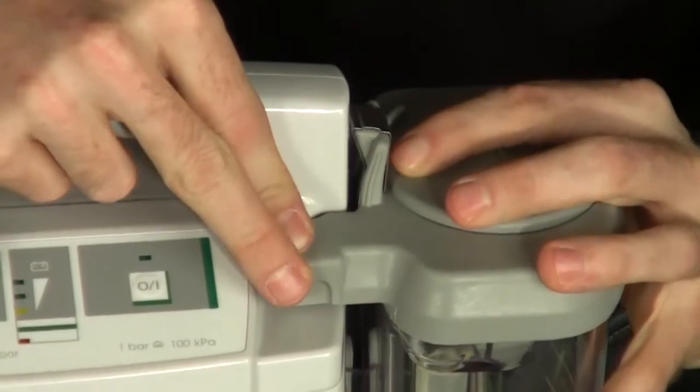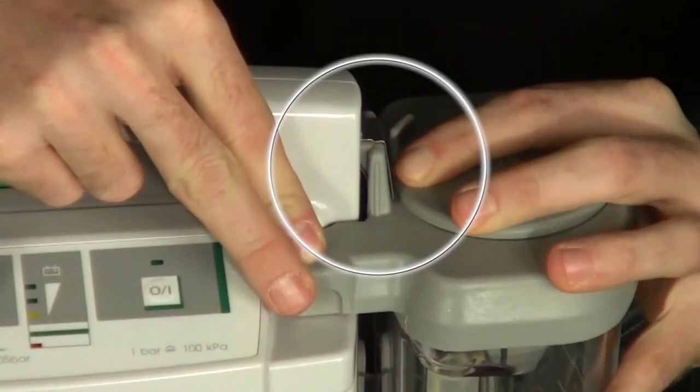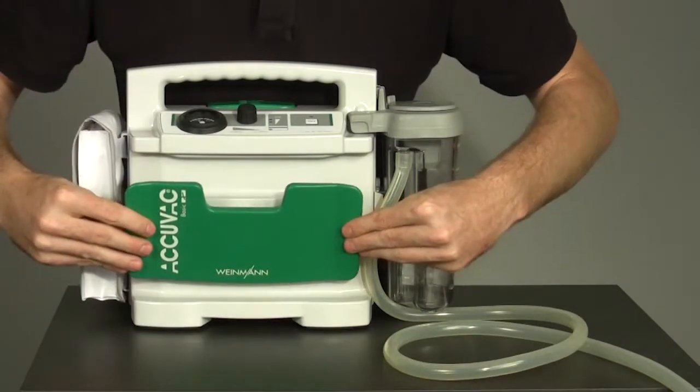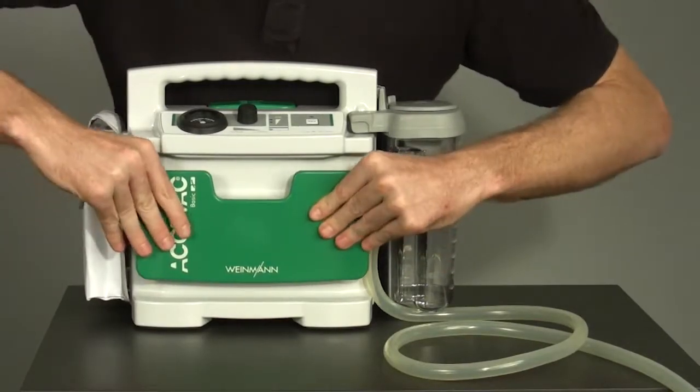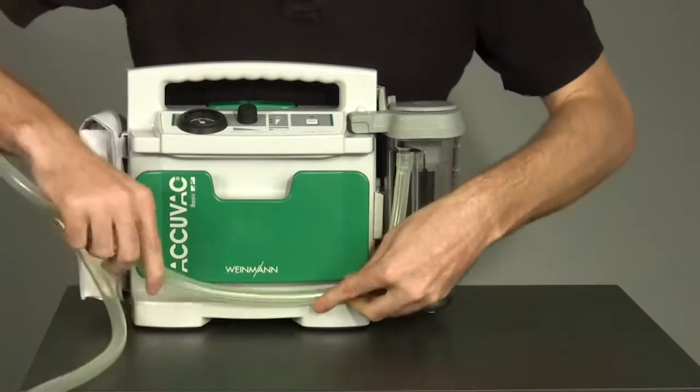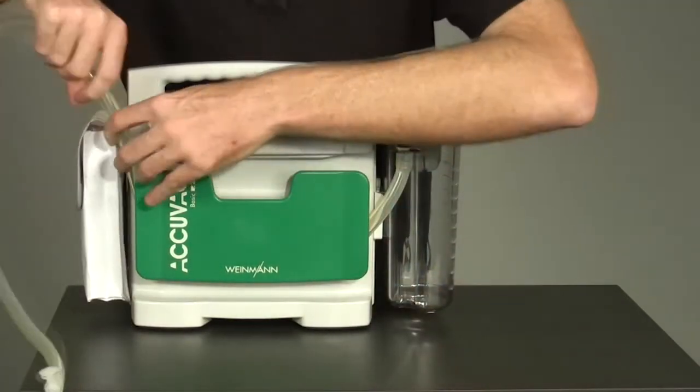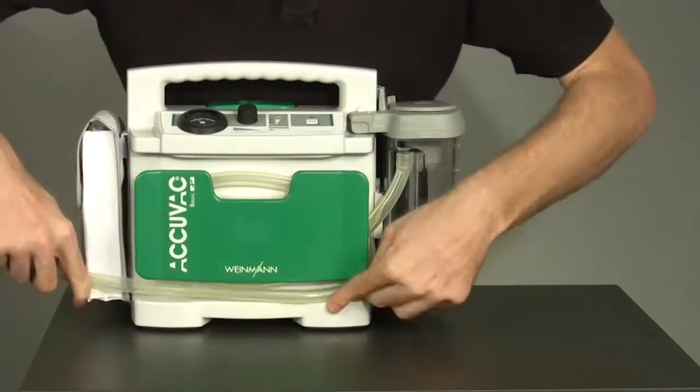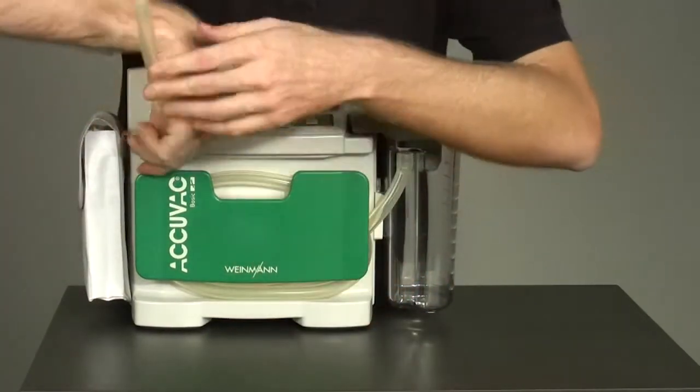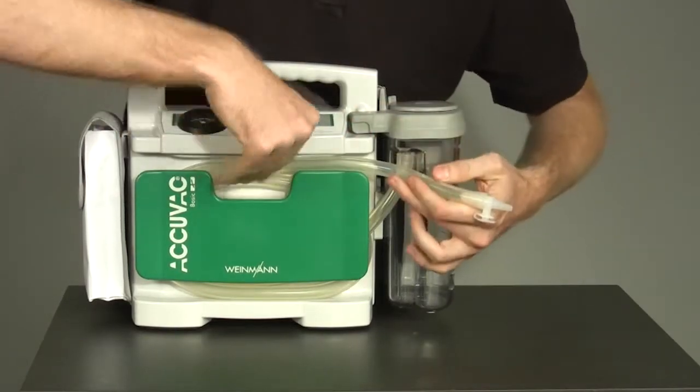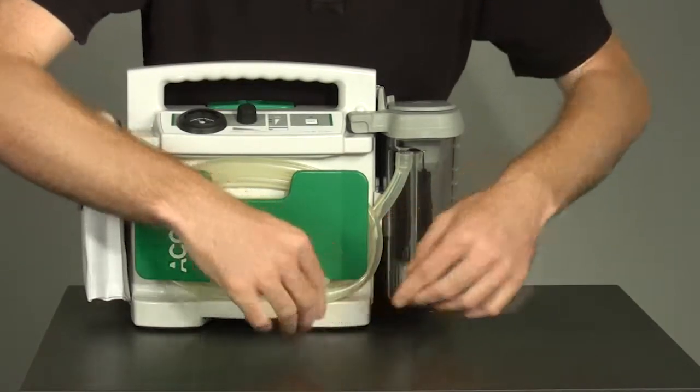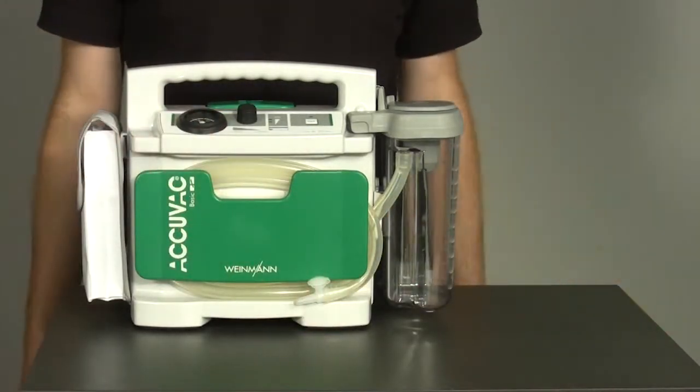When you push the reusable collection canister into place, make sure that the locking tab clicks into the notch meant for it. You can then put the tube holder plate back on the device and wind the suction tube around it. Now your AcuVac Basic is ready for use.